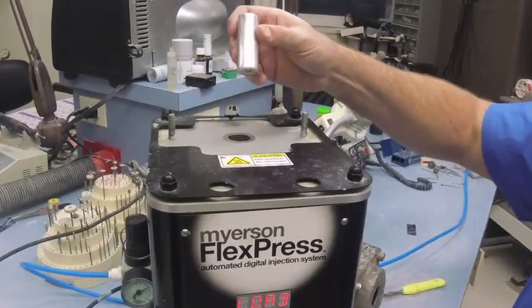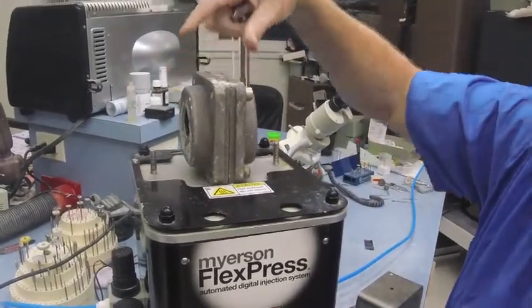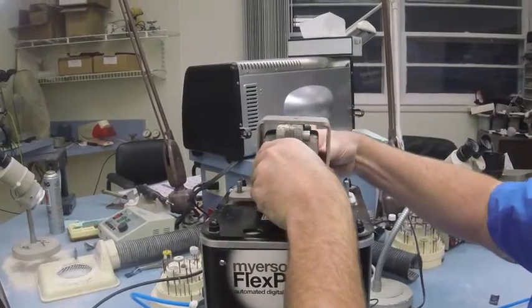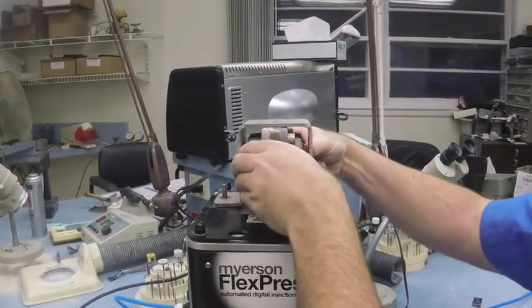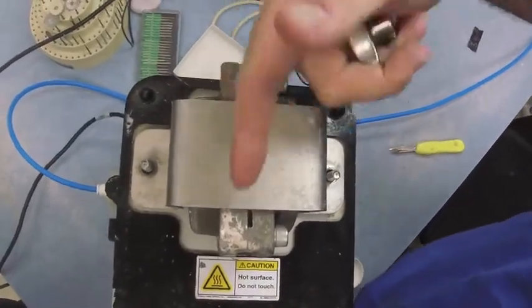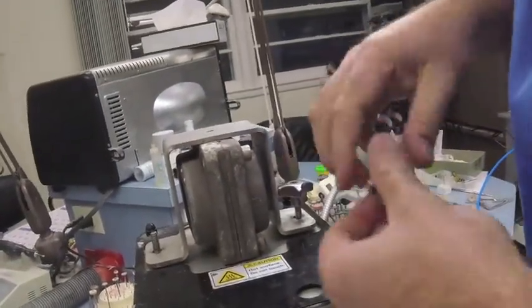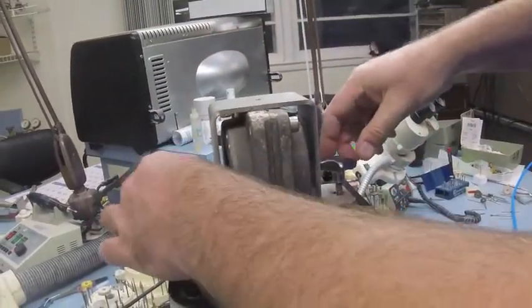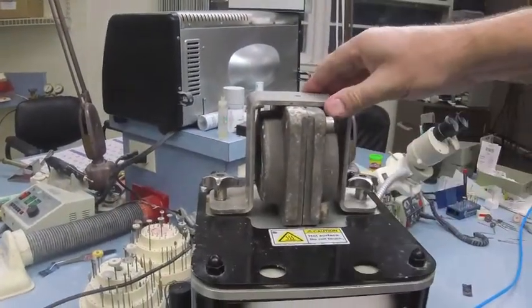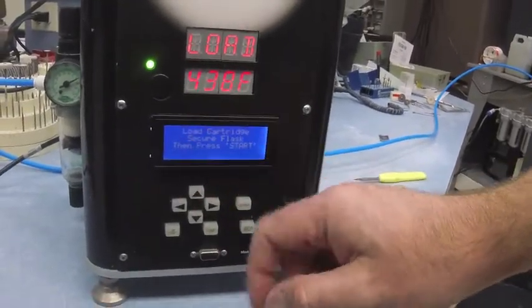Then we're going to do exactly what the machine says: load cartridge, load our tube. Take our flask and center it using the hold-down bracket. Make sure you have about the same amount of gap on either side of the hold-down bracket — that means it's centered. If you look down on top of the flask, you want to see the same amount of flask showing on either side. Then take your hold-down bracket nuts — these don't have to be super tight, just a little tight. There's going to be a gap there; that's fine as long as it's secure.